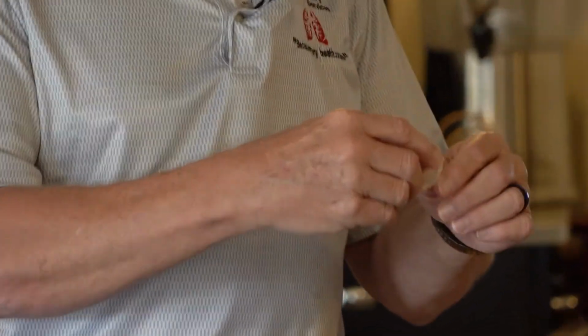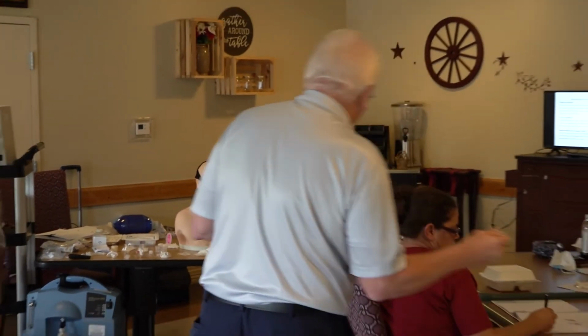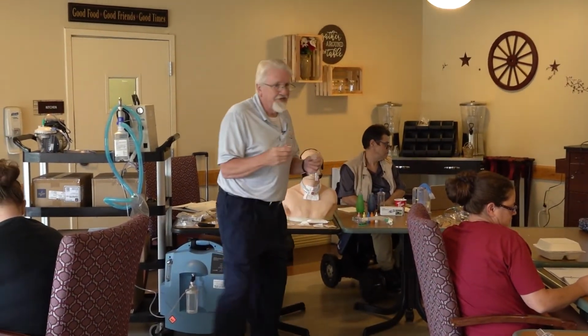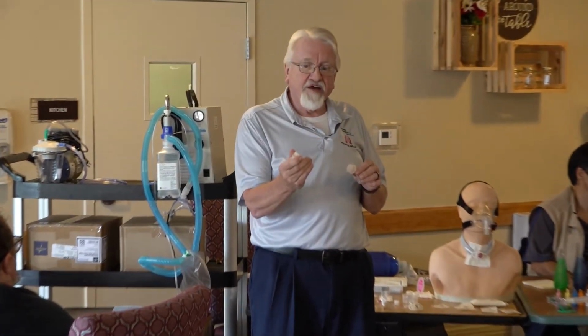They actually make 2 different types of these HMEs. One's high flow, one's high humidity. So the theory, or the practice, should be, while you're awake and active, you're going to use the one that's high flow.